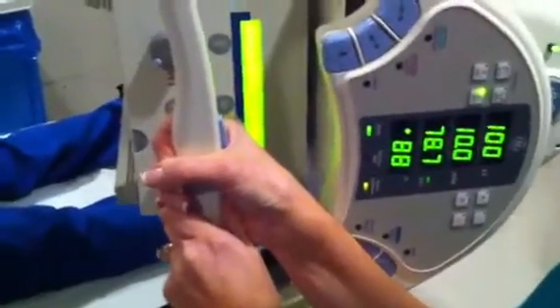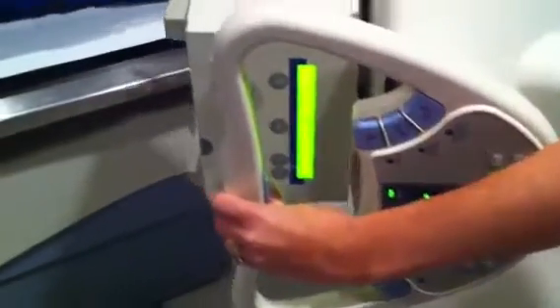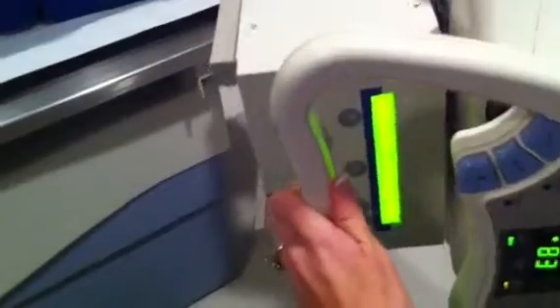This position was chosen because we were laying down in this position. Between 15 and 30 degrees — so more angle. Angle down posteriorly. That's a lot like what we just did, and her arm is out and externally rotated.